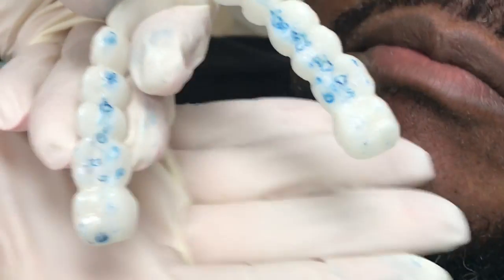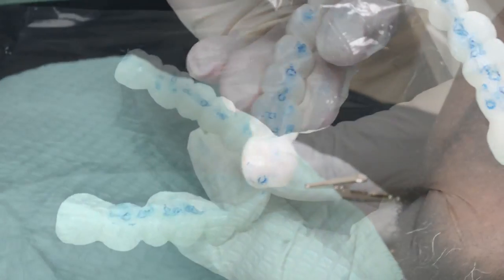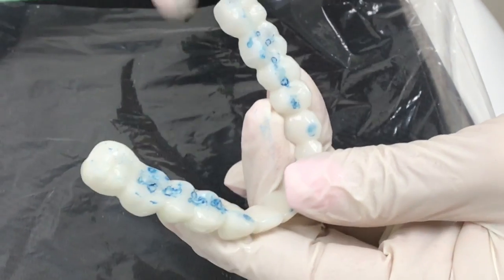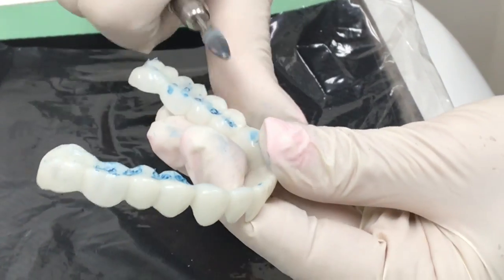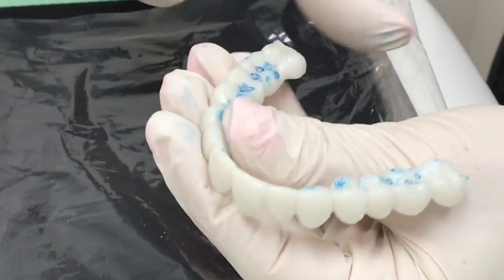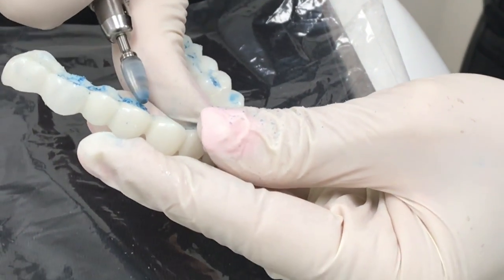And these things fit well. So, can you see the marks? What we want to do is get rid of all of the really intense marks. I'm going to show you how we do it. Okay, so you can see he's got balanced marks, except there's a high spot here and one here. So what I'm going to do is take my special burr designed for this appliance, and I'm going to lighten these areas up. That way he has balance and he's not hitting on one tooth more than the others, because that will cause headaches and it's uncomfortable. We want the patient to feel very comfortable the minute they walk out of our office.